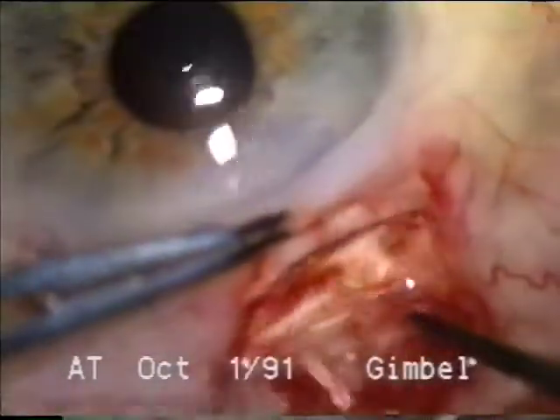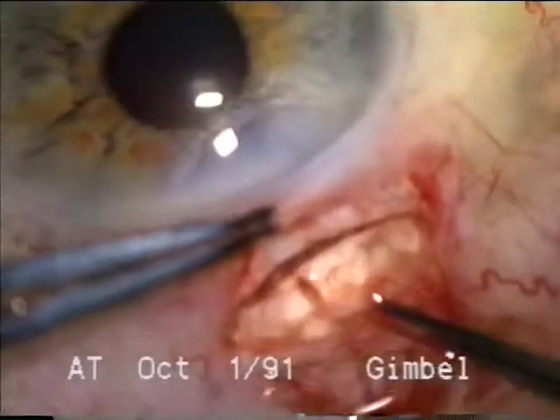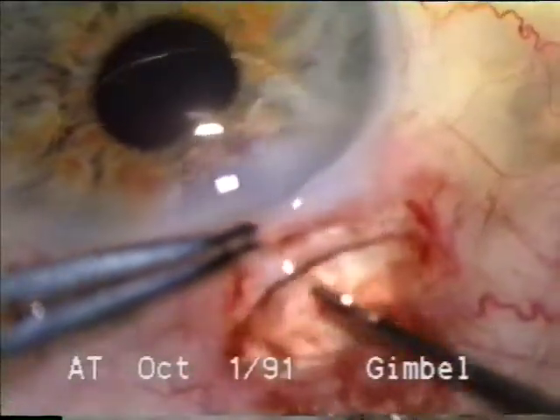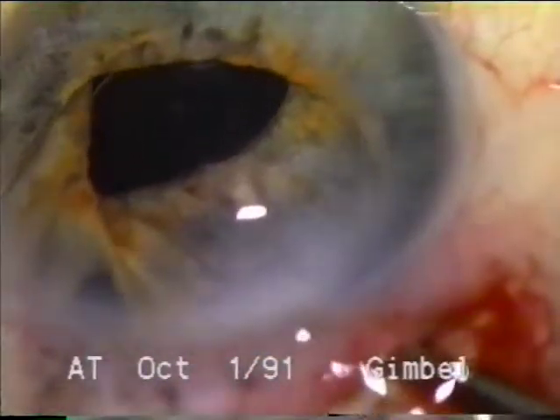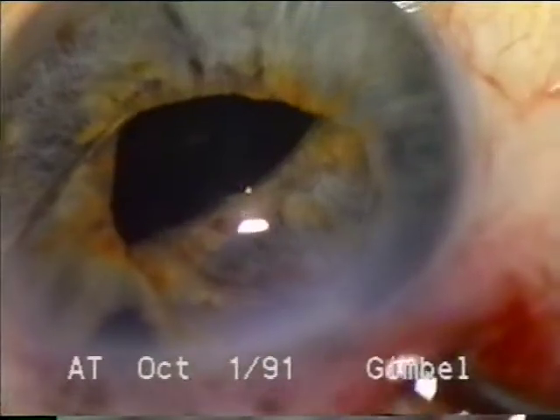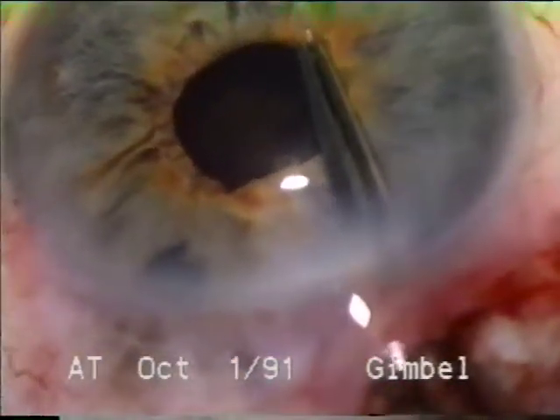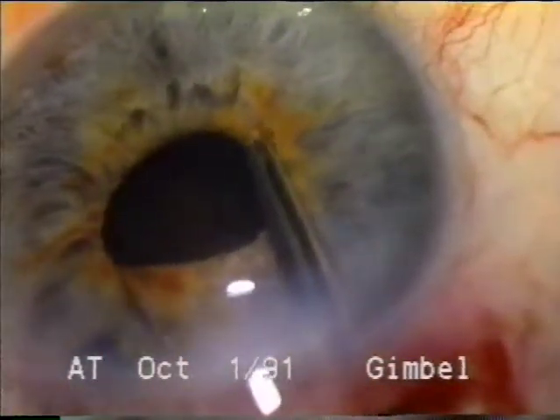Here we see a 5mm lens now being placed within the capsular bag. One can stretch this pupil and verify that the lens is started into the capsular bag and also that the last loop is in the capsular bag before being released. I prefer a 5mm round lens, but many times we have to take a 5x6 lens because of availability.